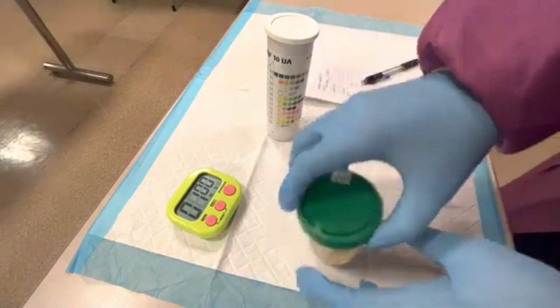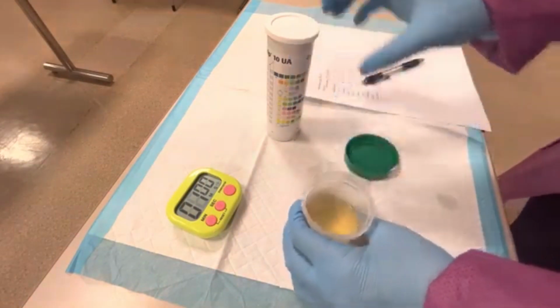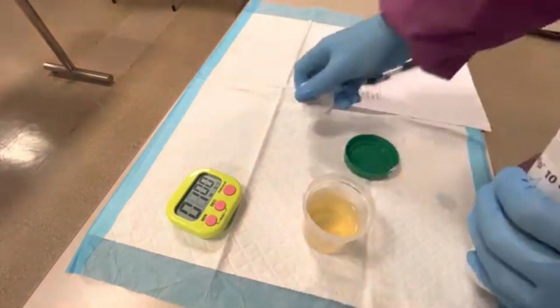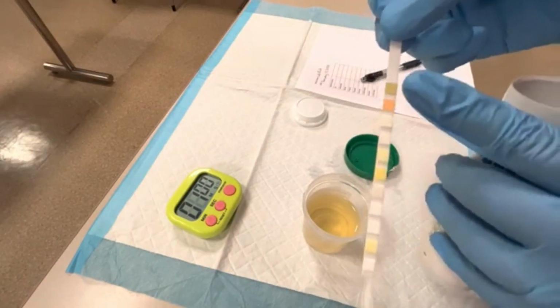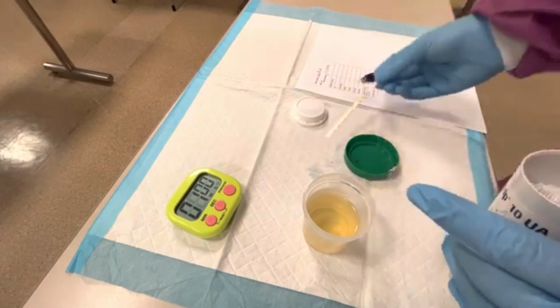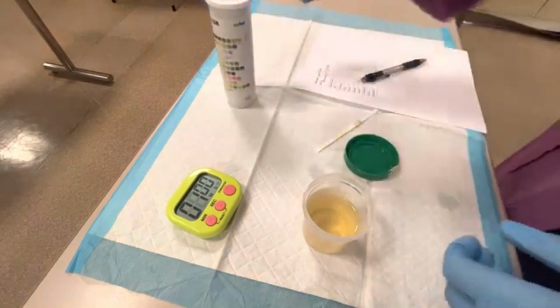Okay, so I'm going to remove the top of this urine container, and I'm going to take one of these reagent strips. So you see how they have little different pads on them? Those pads are going to be changing color based on the contents of this urine.